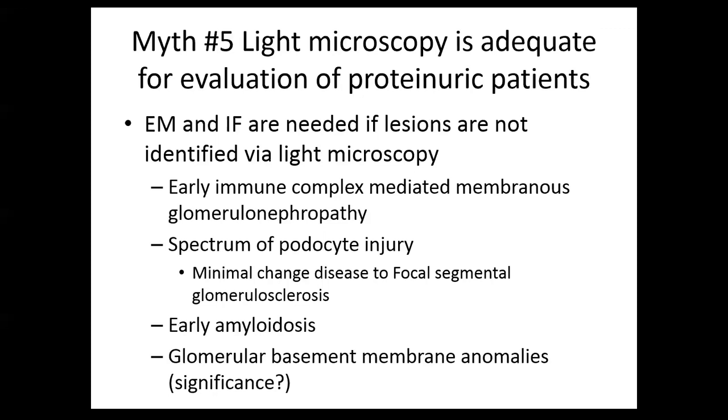And the glomerular basement membrane anomalies, which Dr. Clark presented at ACVP this year. There's a wide spectrum of abnormalities in the GBM, ranging from the true ones that we've been able to identify the genetic cause for, so Alport syndrome, having a mutation in type 4 collagen, and we know what breeds have been associated with it, although we can find new breeds in the future. We've only seen it in dogs. I don't think it's ever been reported in cats. Mary, am I misspeaking?